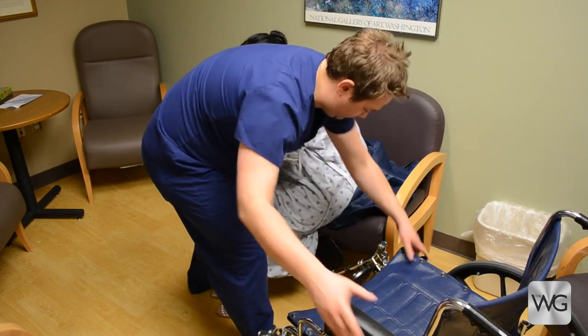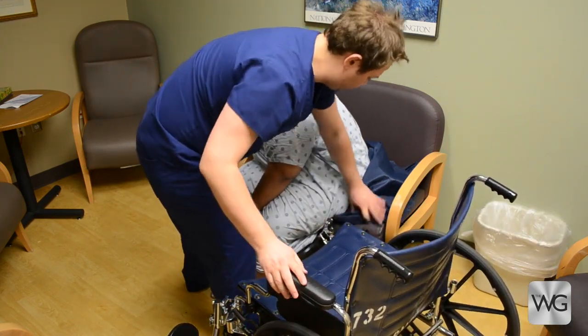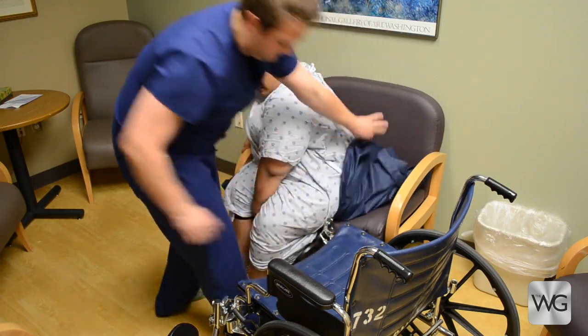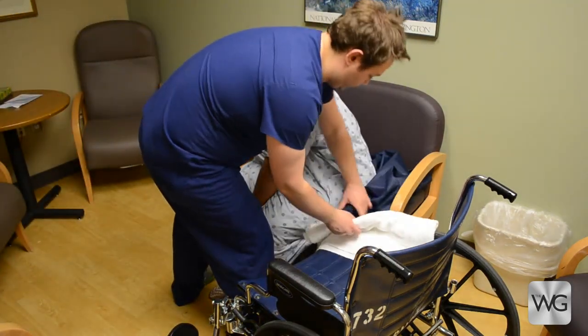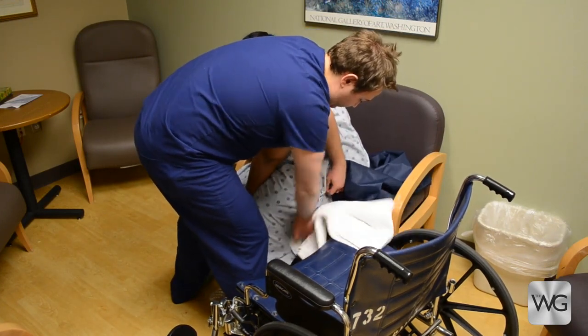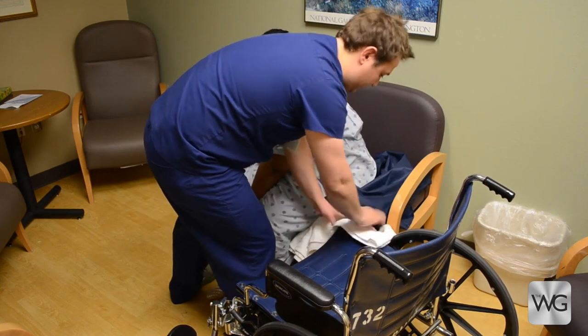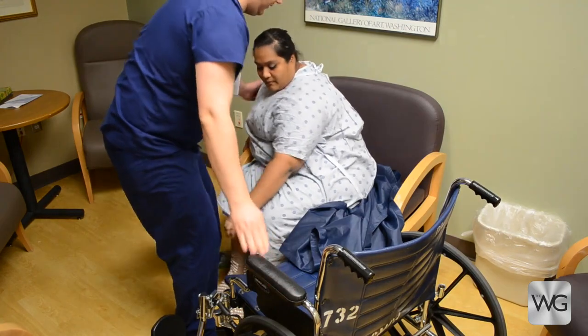The wheelchair is placed near the front edge of the bedside chair and the arm is removed. Folded bed linen or a pillow may be used to bridge the gap between the bedside chair and wheelchair. The caregiver stands in front of the patient, supports the wheelchair with one hand, and places the other hand near the patient's far hip or pelvis.